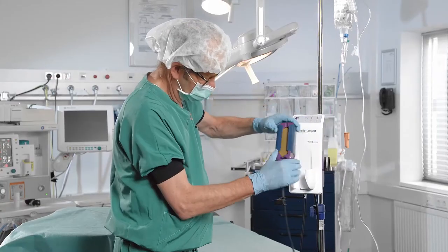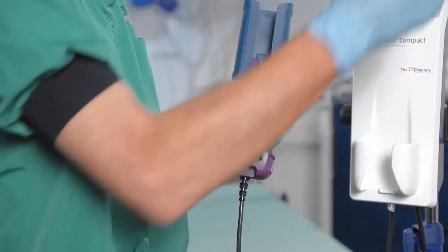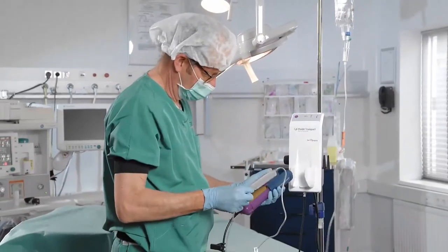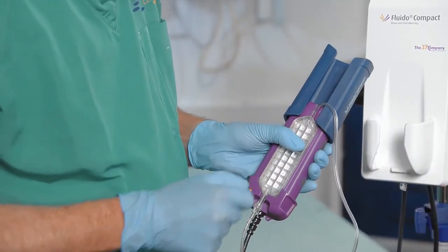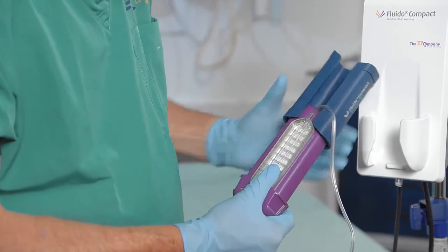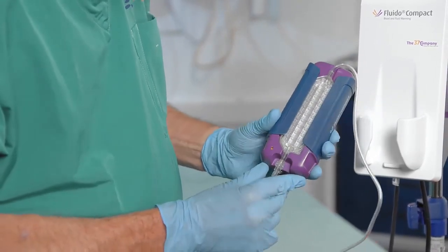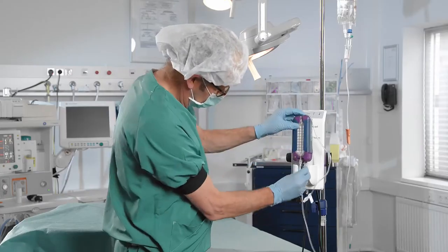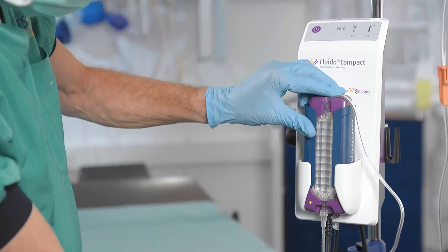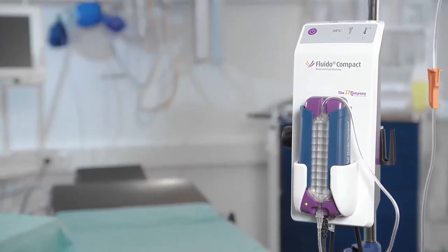Take the warming module out of the warming module holder and open the slider. Place the cassette in the warming module — the cassette fits in only one way. Then close the slider. The status indicator LED on the warming module is now green, to indicate that the disposable set is detected and positioned correctly. Place the warming module back in the holder with the interface cable downwards.